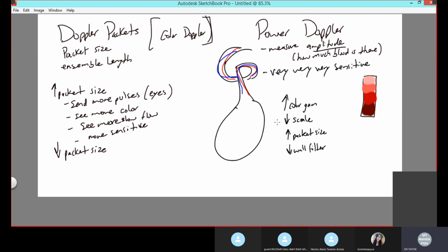Then if you want, put your color Doppler over that little area where I found the trickle and see if you can now find it, and put a pulse wave if you want to see the waveform, whatever. I'm just here to show you if there's anything there. I'm not going to measure it. I'm not going to tell you if it's going slow or fast. I'm just simply telling you if there's a little bit or if there's a lot. The concentration of it. That's it.